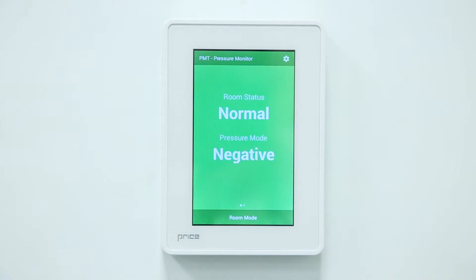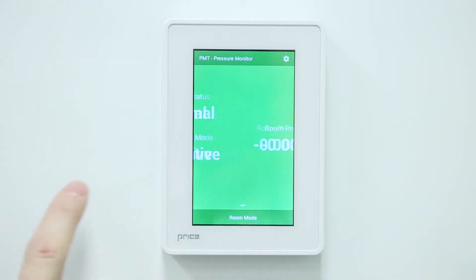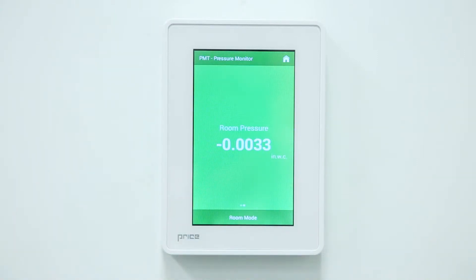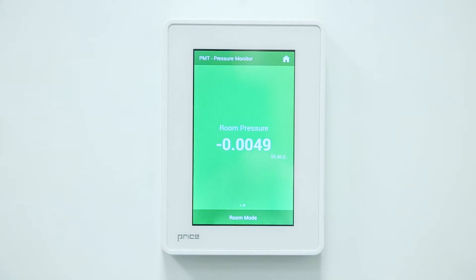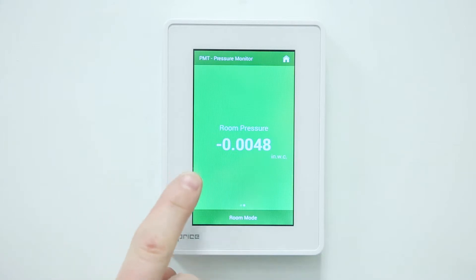By swiping to the left, the second page appears. The second page indicates the room pressure value for review or documentation. Please note that the PMT will return to the home page after a set amount of time, or simply by swiping to the right.